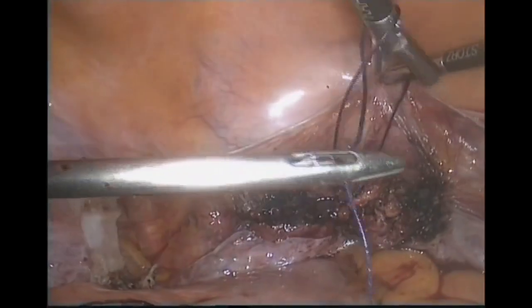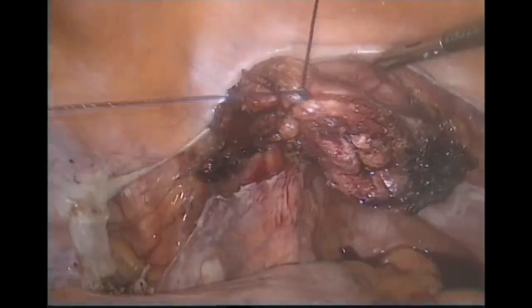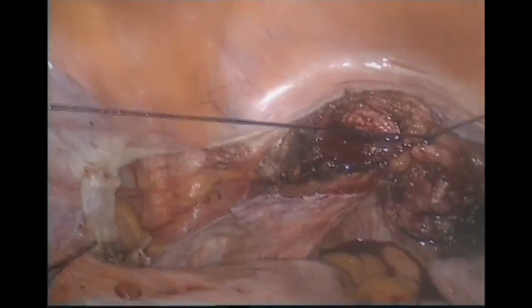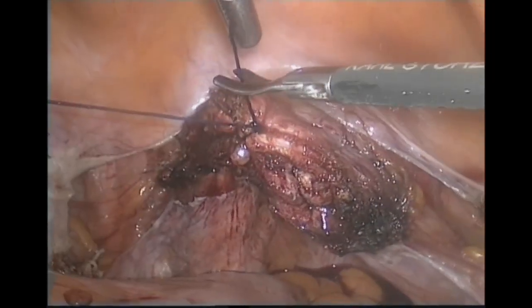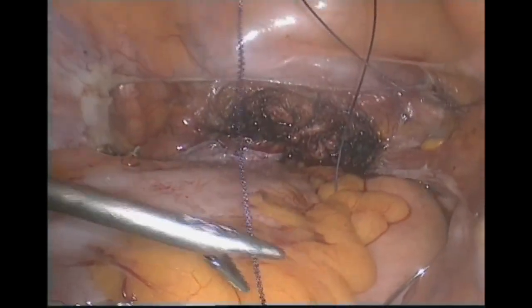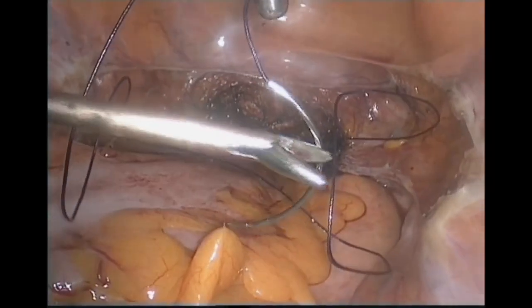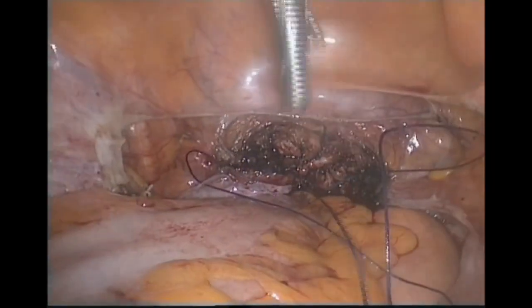So go with a hemostatic check, reduce the pneumoperitoneum to 7 to 8 millimeters of mercury to unmask venous ooze that tamponade may hide inside the pedicle, vaginal angle, the bladder and the IP stump. Ureteric integrity is very important, and confirm peristalsis. Maybe you need cystoscopy, maybe methylene blue, check the urinary bag. Very, very important. Okay.